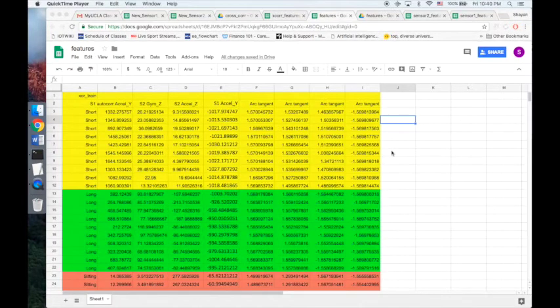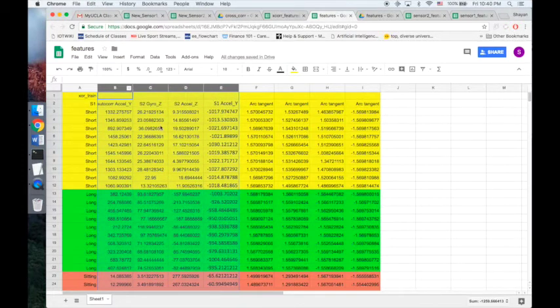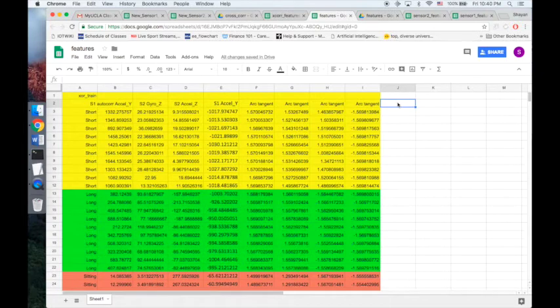Now we have extracted 4 features from our raw motion data output files. The features are as follows. From sensor 1, autocorrelation of the acceleration y, mean of the acceleration y. From sensor 2, mean of gyrometer z data, and mean of acceleration z. These are the raw form of the features. After iterations with the neural network, it was found that the performance enhances by mapping the numbers within a fixed range. So it was decided to map the numbers to between -π/2 and π/2 using an arctangent function. So here we have the arctangent of our original features, and that corresponds to the final form of the features.